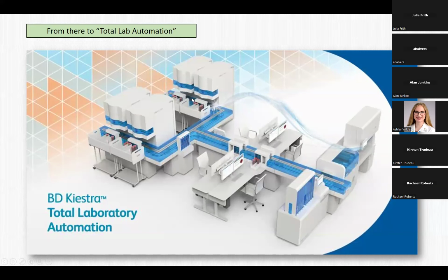It's going to take a photograph at time 0. Then it goes in the incubator and incubates for whatever amount of time is pre-programmed. You can say, I want my urine cultures to go for 18 hours, I want my sputum cultures to go for 24 hours, whatever. When that time is up, it's going to pull the plate out and image it. The image is then available on these reading stations. Notice the reading stations are directly on the line here.